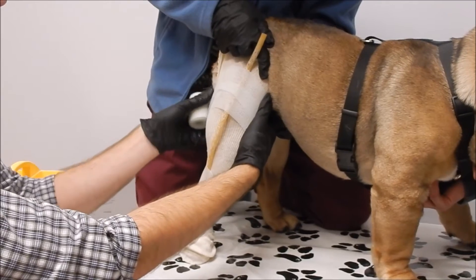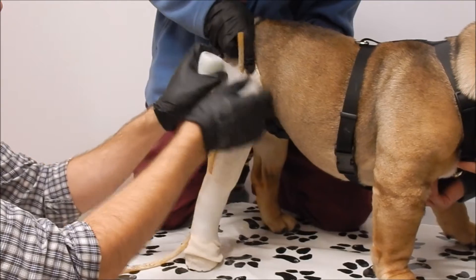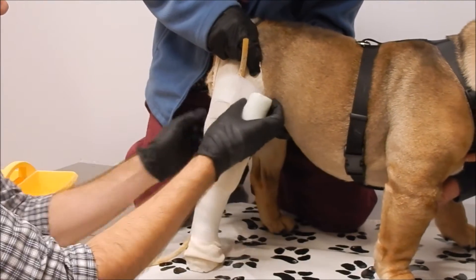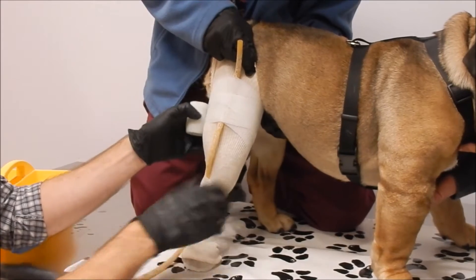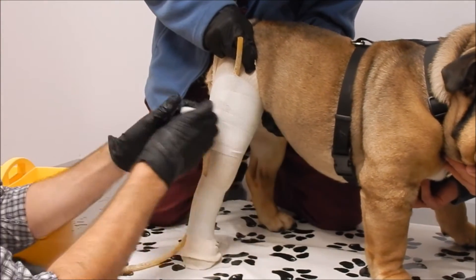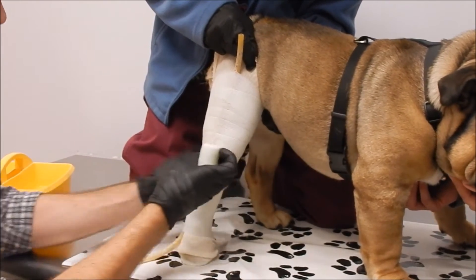So Terry doesn't have to work as hard holding the tube in place. My goal is to get as high into the groin as I can so I can get as much information about the leg without making a guess. Just kind of going down — I want to get good overlap as I'm going down so it all sticks together.